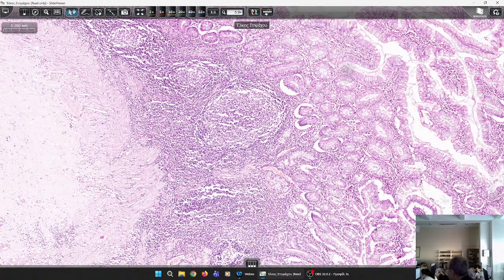This is atrophic gastritis, and since there are so many lymphoid follicles, it is most probably of Helicobacter etiopathogenesis, in contrast to the previous gastritis that we saw in the body of the stomach, where you might think that it might start from the pylorus and continue to the body, so it would be an extension of a Helicobacter gastritis.